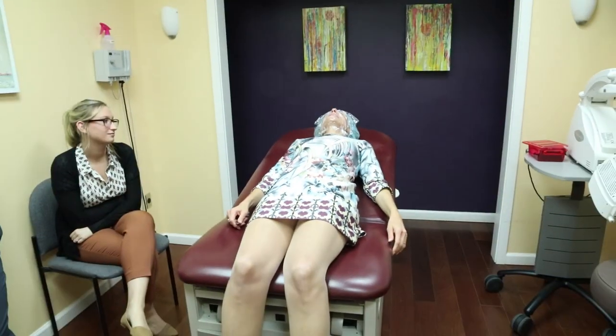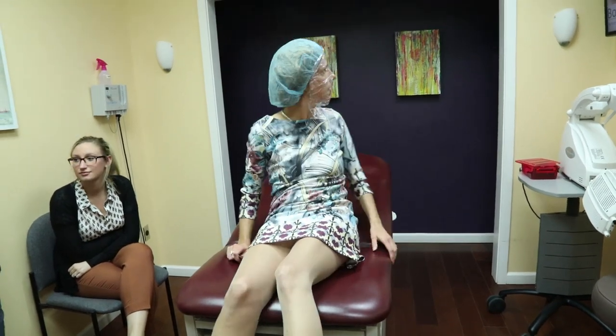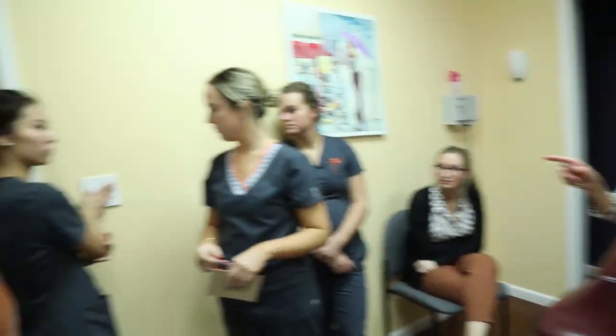And now the patient can lay comfortably in a dimmed room. Let's dim the room.